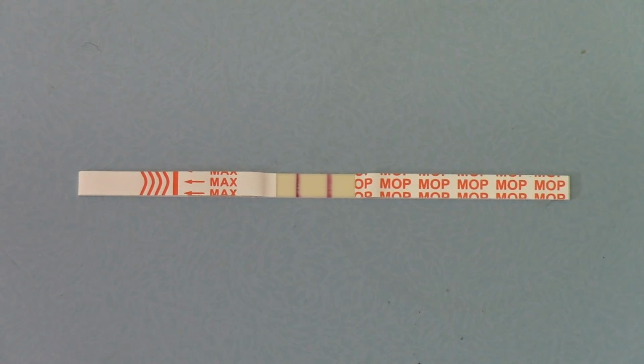So the majority of tests are going to be using a urine form of test strip, either a single strip or, far more commonly, where these test strips are embedded into a multi-panel cup or dip test, so that a combination screen is being performed at any one time together with a heroin or opiate screen, with up to 10 or 12 common drug groups being screened simultaneously.